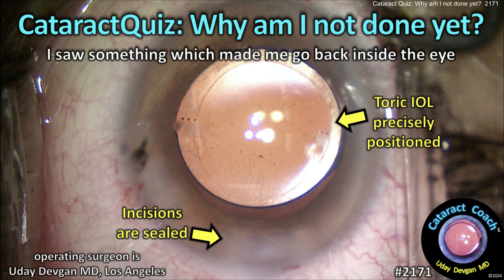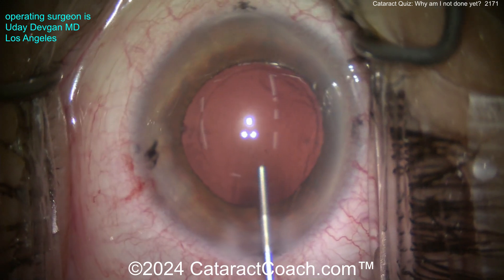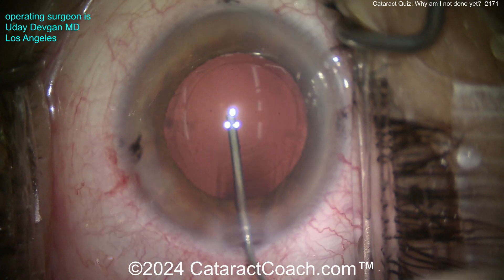CataractCoach.com cataract quiz: why am I not done yet? I saw something which made me go back inside the eye. Watch the case carefully and see if you can figure it out.